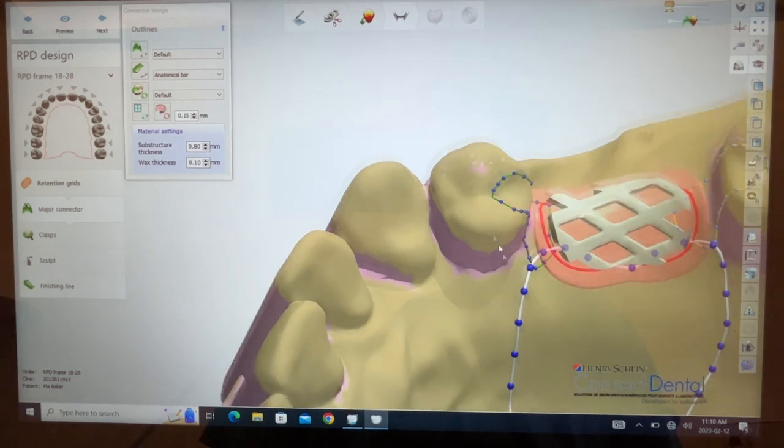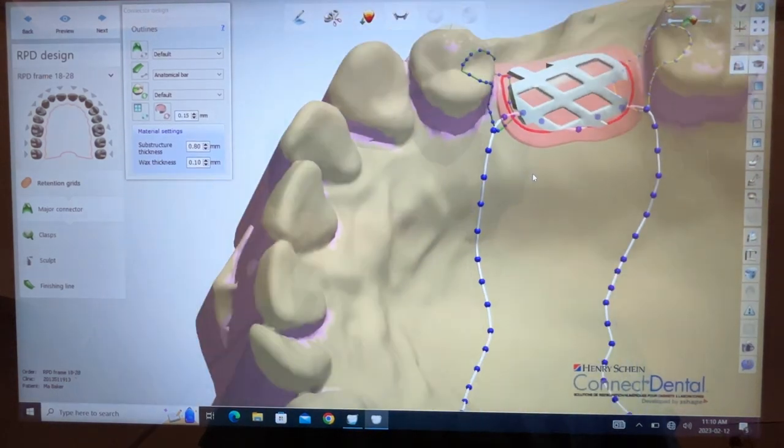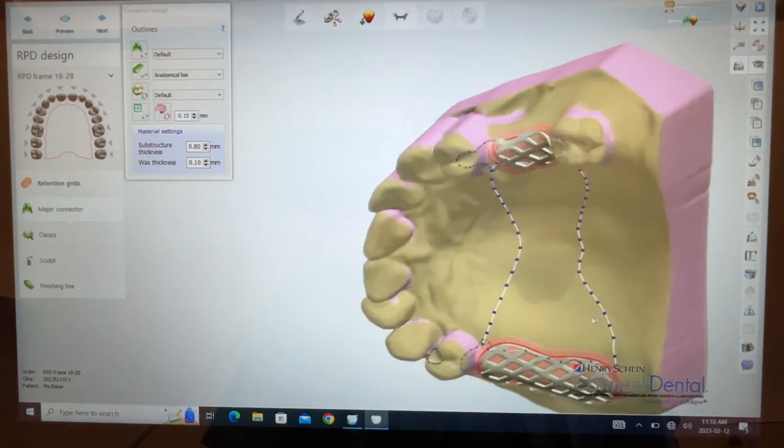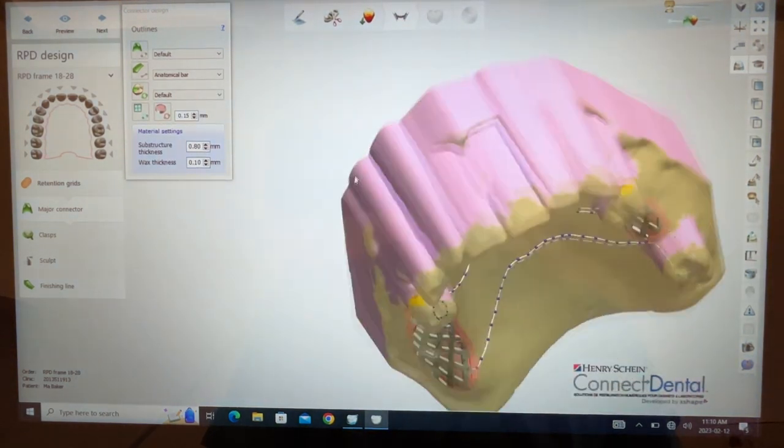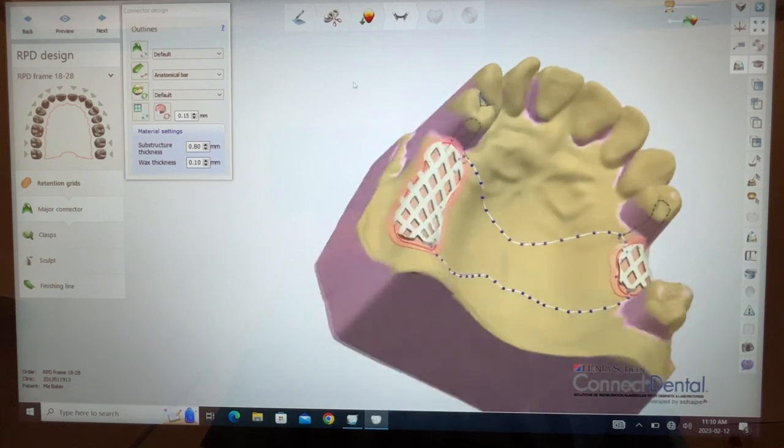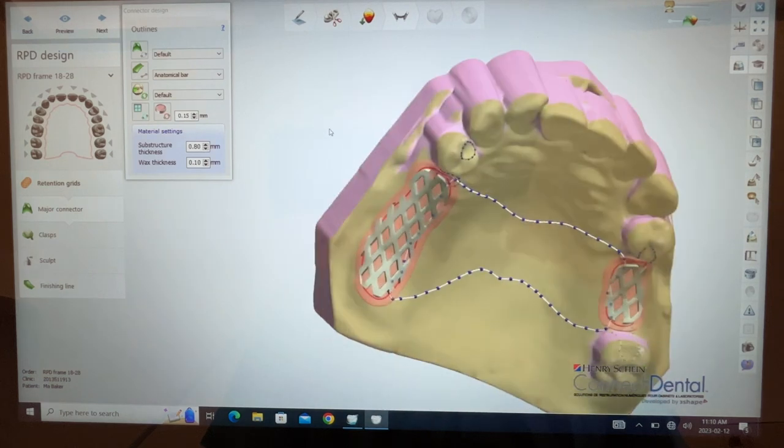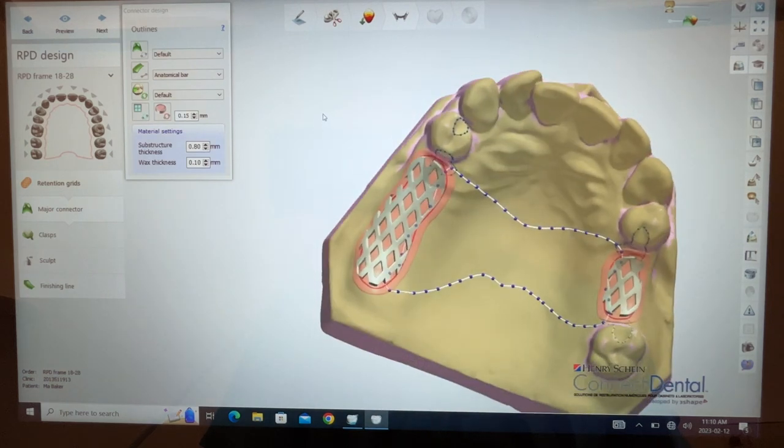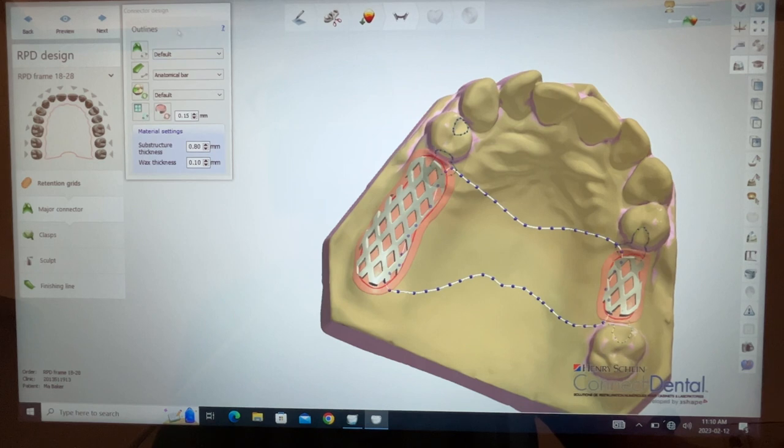Move to the center of my screen. I'll zoom out for you. So there we have major connector and rest design. Let's see what it looks like when we hit next.